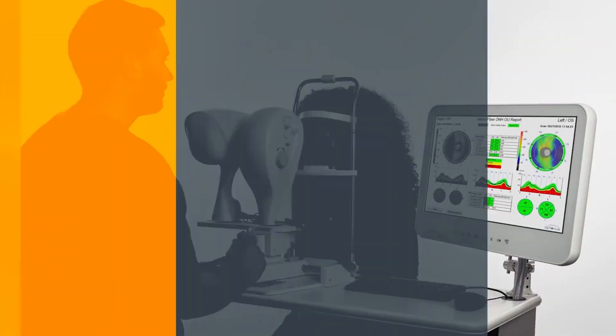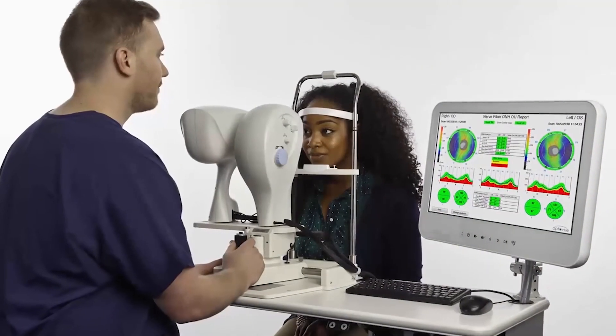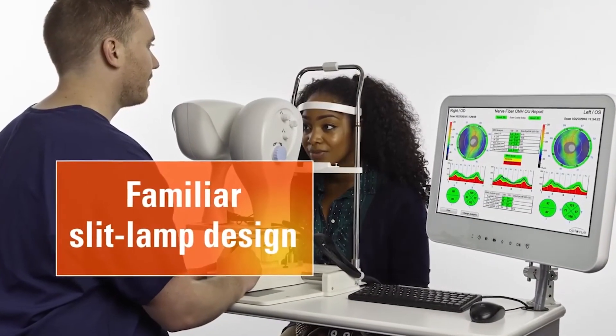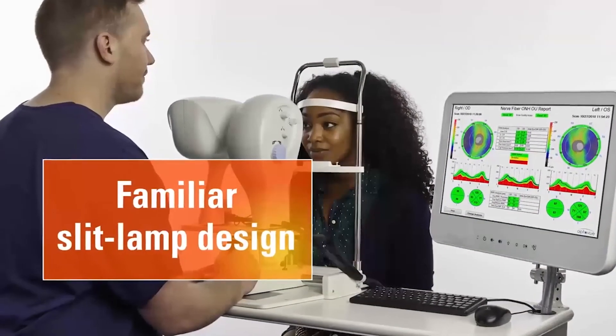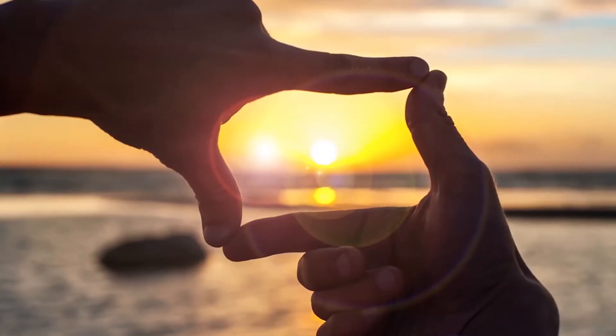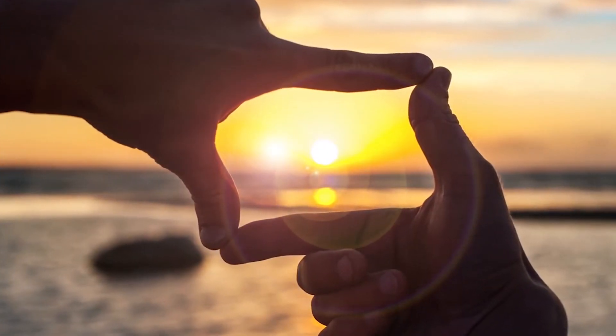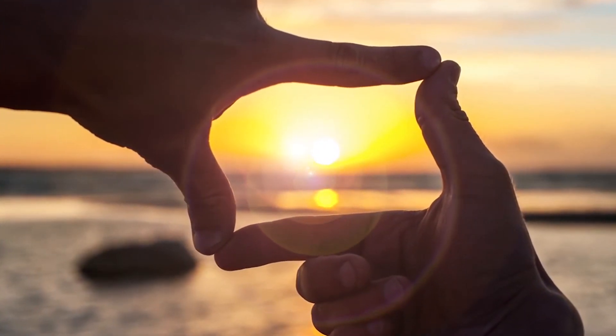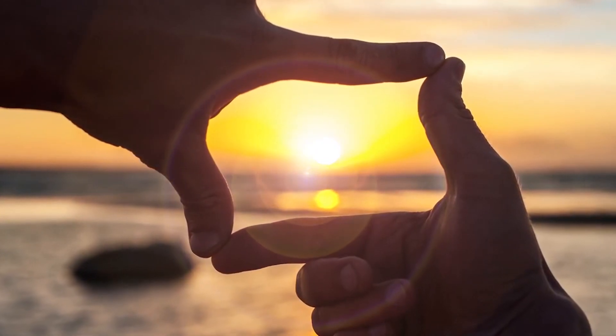As for operational ease, both systems use a familiar slit lamp design that makes scanning a breeze. The time for accessible and affordable OCT solutions is now.